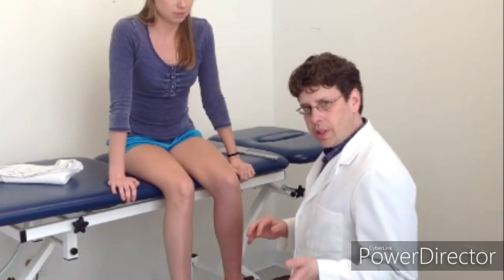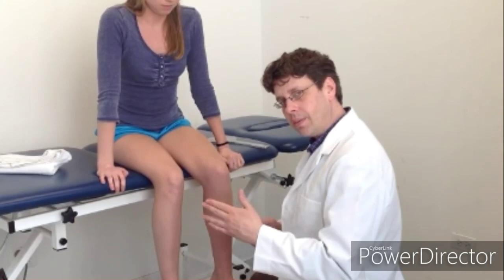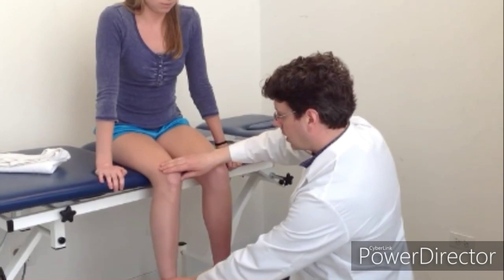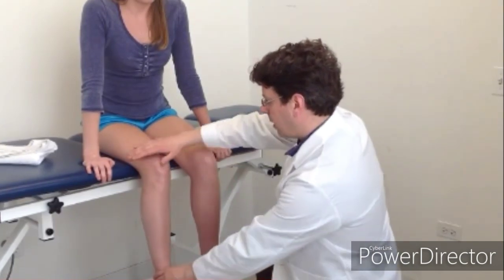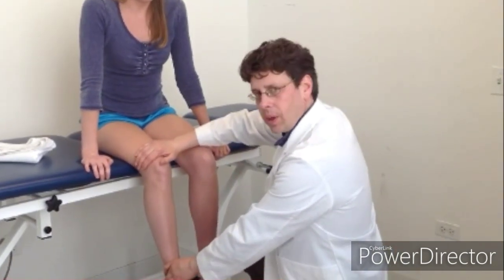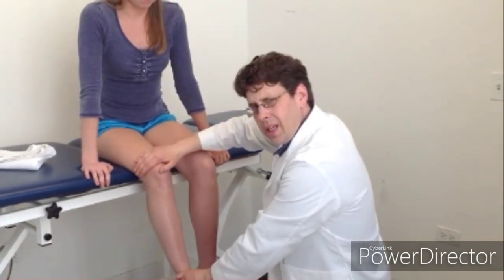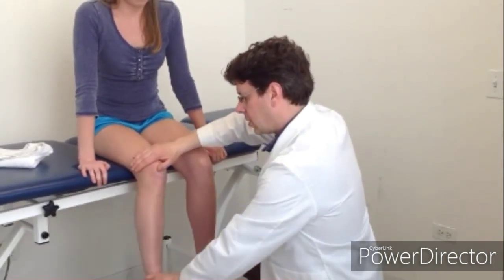So we've just looked at the positioning of the goniometer. Before I take a measurement, I want to make sure that Kelsey can move through the internal and external range of the hip motion. So I will make sure that we can move in this direction before we go in the internal rotation. This will provide a more accurate measurement. You want to make sure that you're zeroed out with the goni. My hand will be placed here at the distal femur, and I will show her the range this way. This hand here is to prevent any excessive abduction or adduction or flexion at the hip as we're taking her through this range of motion.